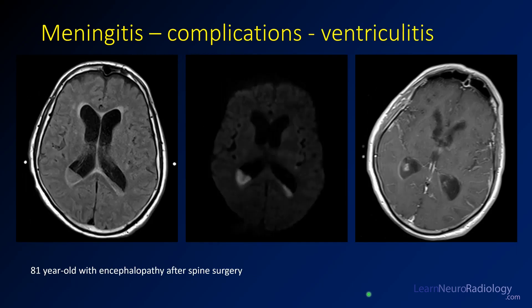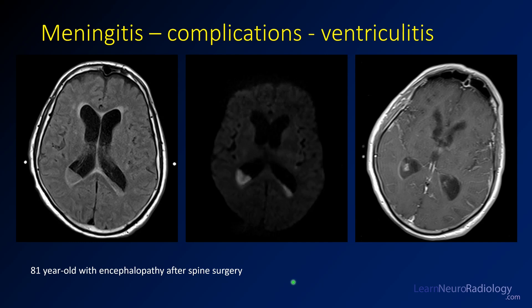Another complication of meningitis is ventriculitis, where pus spills into the ventricle. On FLAIR you see material collecting in the dependent portions of the ventricle with non-suppression in both the right and left occipital horns. On diffusion that material is hyperintense, with some material in the sylvian fissure. On post-contrast imaging there is a thin rim of enhancement around the ventricle. This patient had encephalopathy after spine surgery, developed a post-surgical infection that spread to the brain causing ventriculitis and meningitis. Ventriculitis is a severe complication with very high morbidity and mortality.